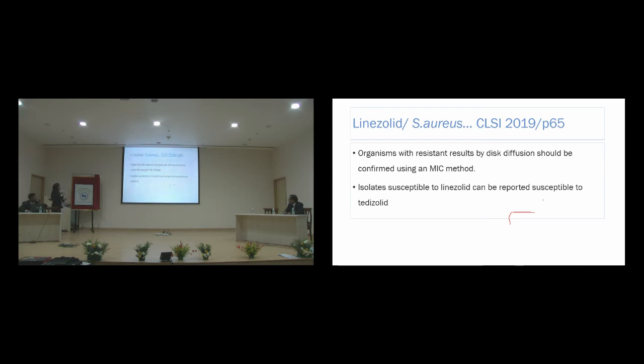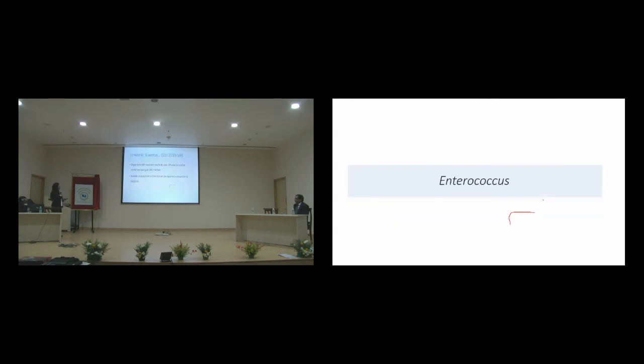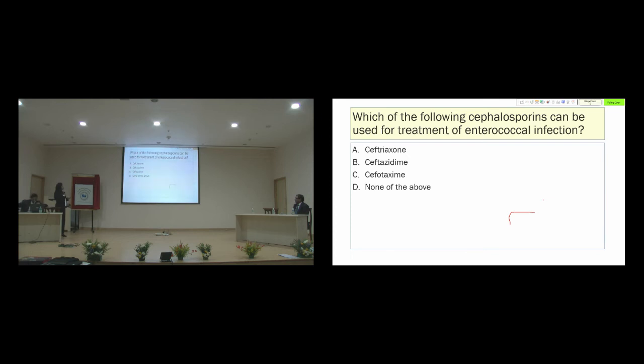Next is a note on linezolid when we are testing for Staph aureus. So an organism with resistant results by disc diffusion should not be reported resistant directly. It should be confirmed by MIC method. And if it is sensitive to linezolid, it should be reported susceptible to even tedizolid. Next, coming to enterococcus. So please answer this question. Which of the following cephalosporins can be used for treatment of enterococcal infection?